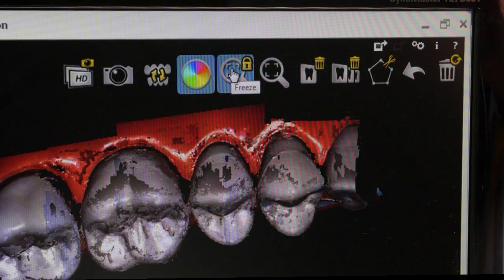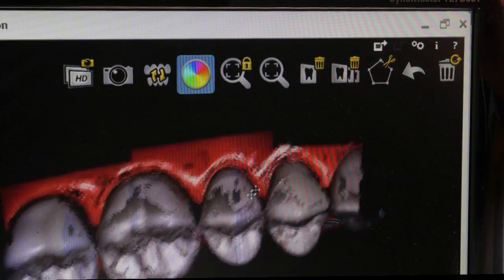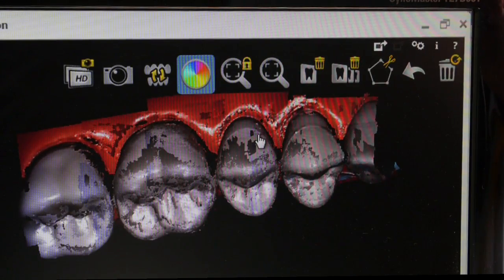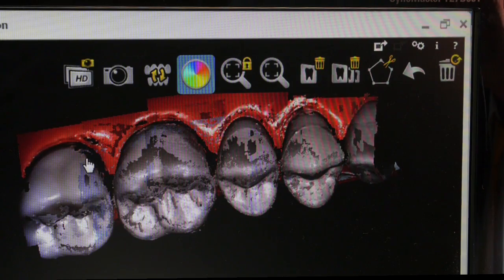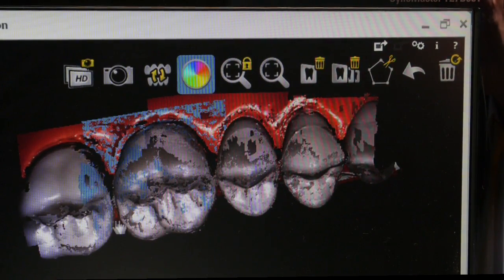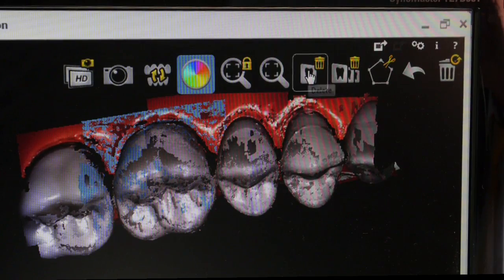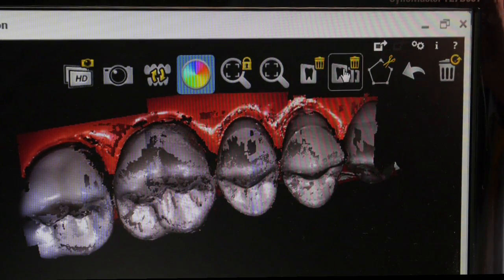To unfreeze, you just unclick again. These two buttons are delete buttons. This deletes one section of the arch — if I highlight there, you'll see it goes blue. That area of blue, I can now delete a single frame or I can delete everything.